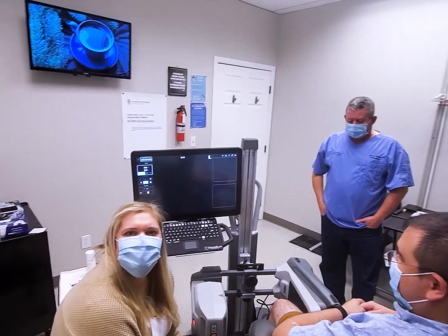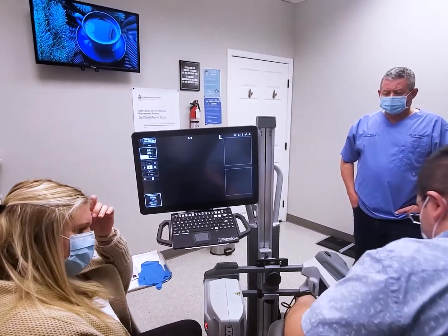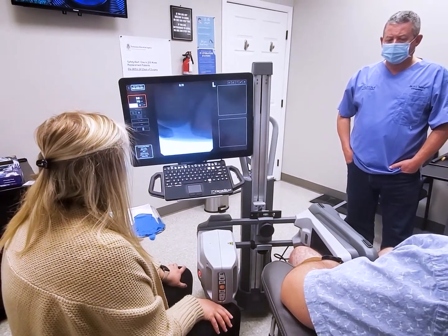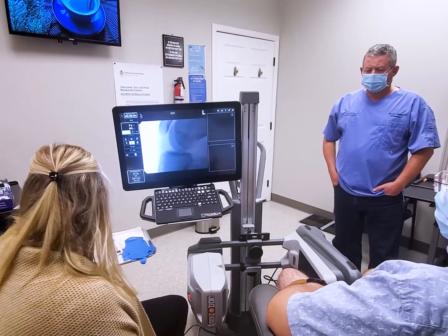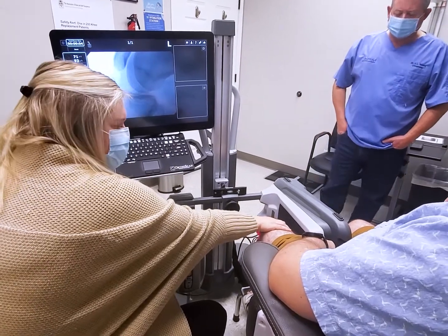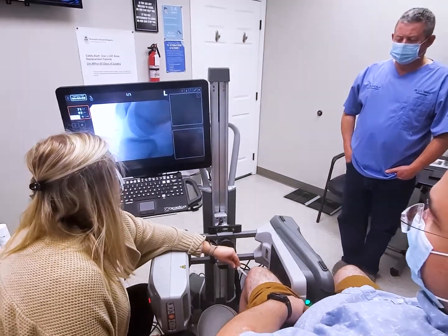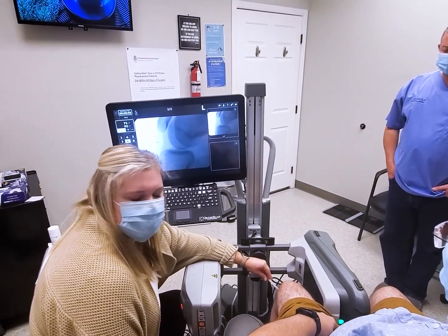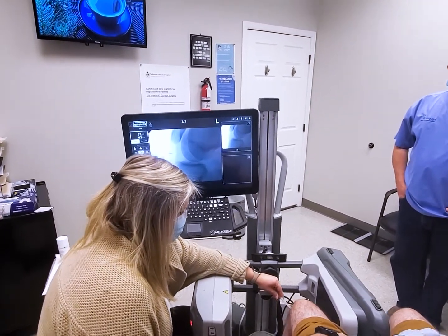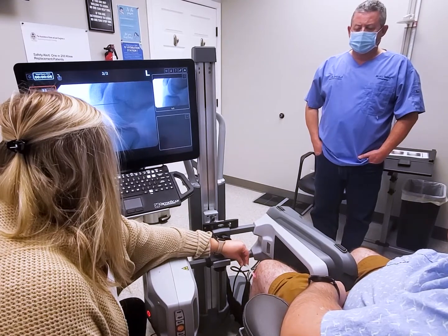So my name's Kelly. I'm the nurse practitioner here at Advanced Regenerative Medicine, and I do all of the knee injections. This is our fluoroscopy machine. The first thing I do is I take a picture. This is kind of my base picture to make sure that I'm in the right anatomical area, which I am. Next, I feel for some anatomical landmarks. Gauge where my needle is going to go, and it's right about where I want to be. So I'm just using the needle cap right now to make an indentation in the skin. And then I take a second picture just to see about the depth that I should be inserting the needle.